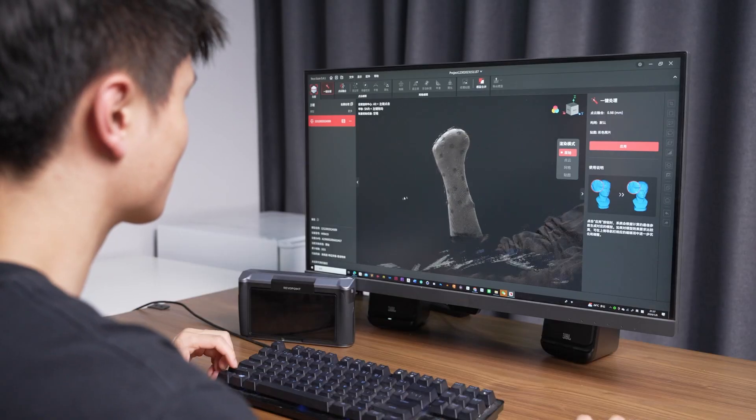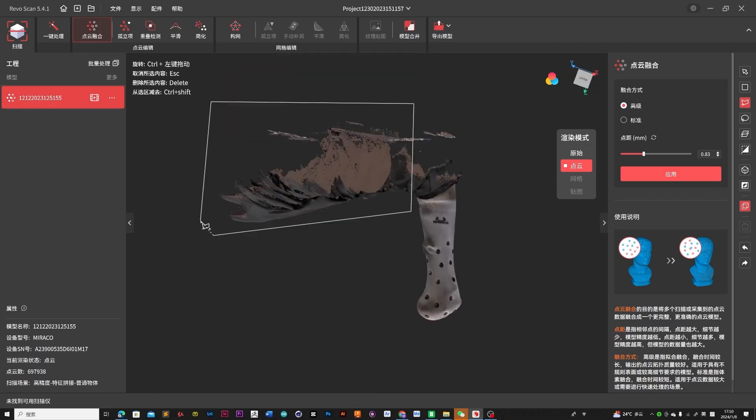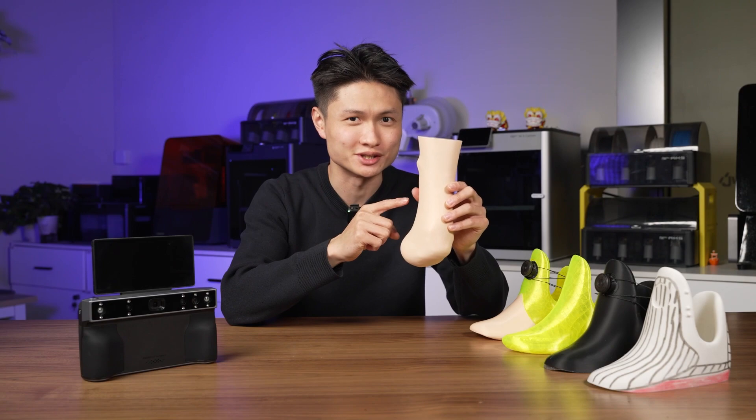After he gets home, Owen gets on the computer and further processes the 3D model on Revo Scan software. Once completed, he 3D prints it and then has his model for further research for the prosthetic leg.